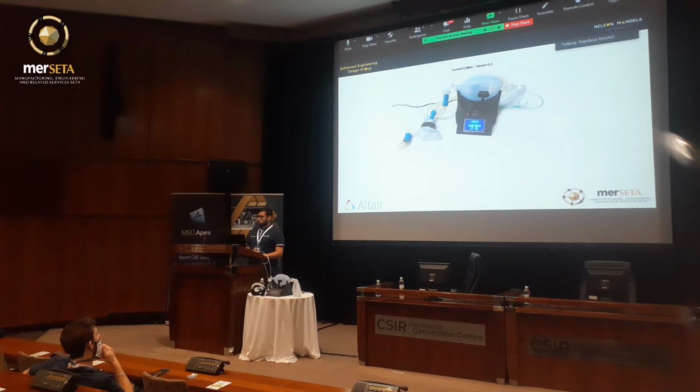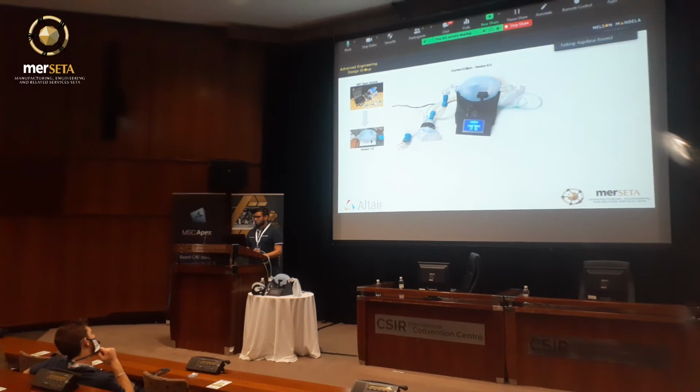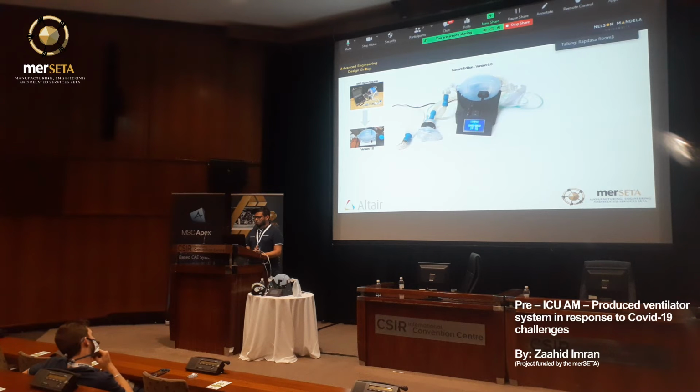So as mentioned before, the ventilator was derived from MIT's open source ventilator. However, our first concept started off with a single pusher arm system that inflated and deflated the ambibag. The pusher arm had a flat and large surface area to ensure maximum deflation. A major problem with this configuration was that as the pusher arm engaged, the ambibag would basically curl into the base of the pusher arm, and that would cause a restriction on the airflow out of the ambibag.